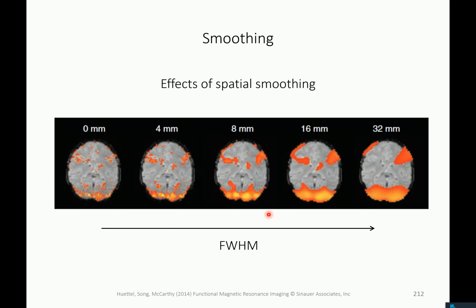And you apply this filter essentially for all data points. So you compute the weighted average. You do piecewise multiplication of these things, and then at this location you sum over them. So you essentially do a dot product.